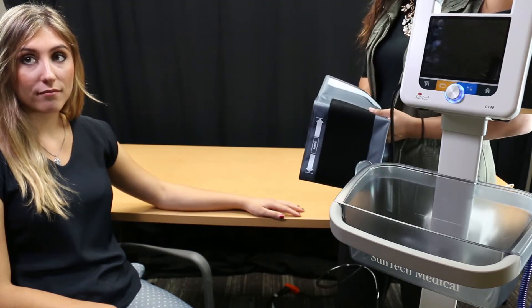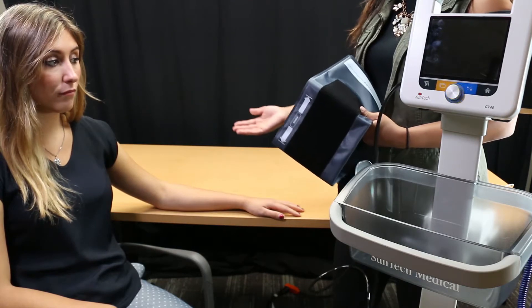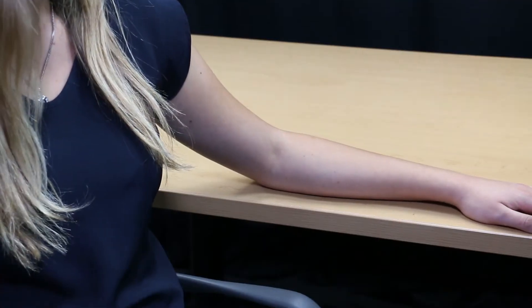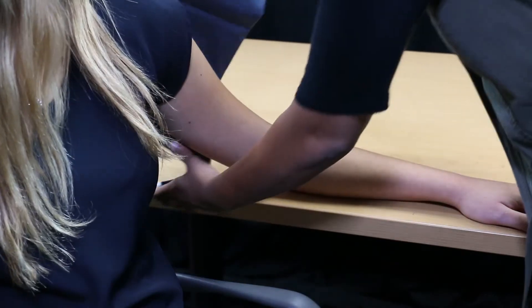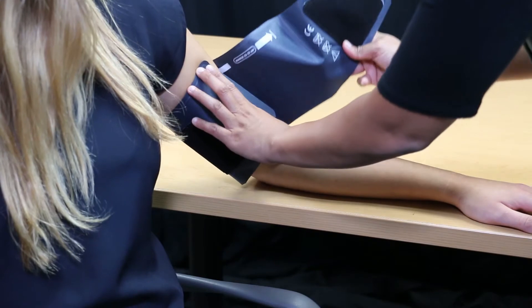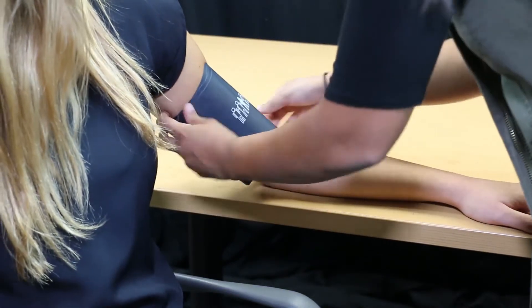According to American Heart Association guidelines, the patient's upper arm should be fully supported and resting at heart level. Wrap the cuff around the patient's arm, making sure the cuff index line falls within the range markers printed on the cuff. If not, select a larger or smaller cuff to ensure optimal BP measurement accuracy.